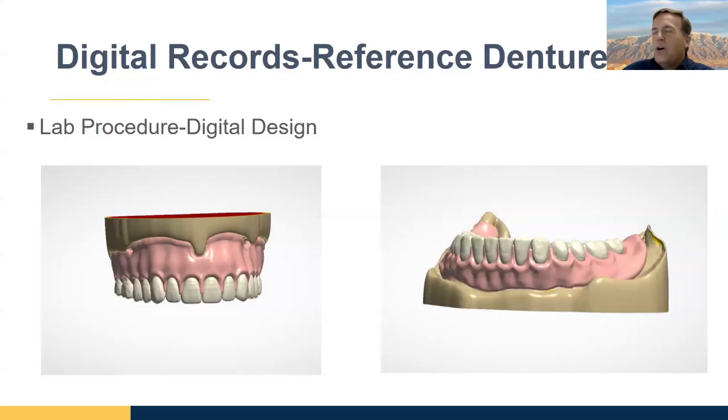The exocad ones, honestly, the proposals that I usually get are just an irritant that gets in my way, because I find that you have to define the first premolar and hit it just perfectly, or else it messes up the proportions between the anterior and posterior teeth. Like I said, what it does do is for double arch cases, it imports the posterior teeth in alignment to each other, so that you have an ideal occlusion to prevent interferences.